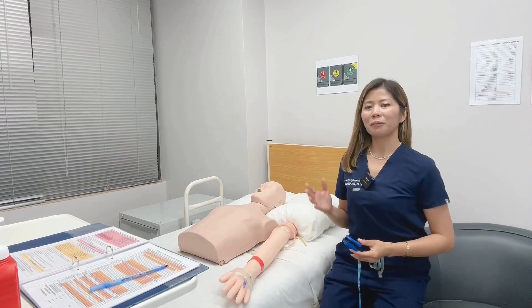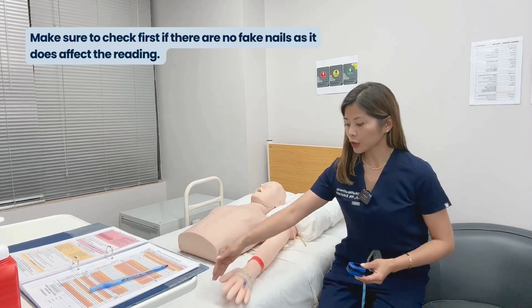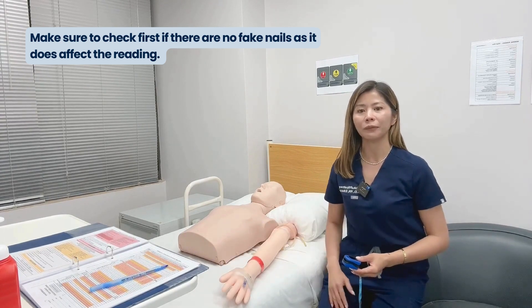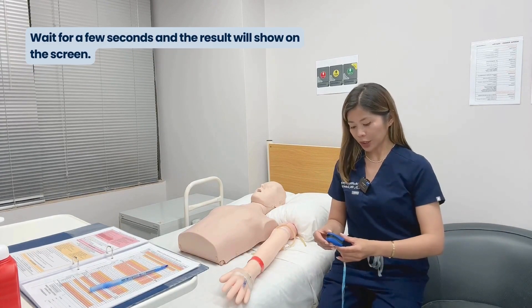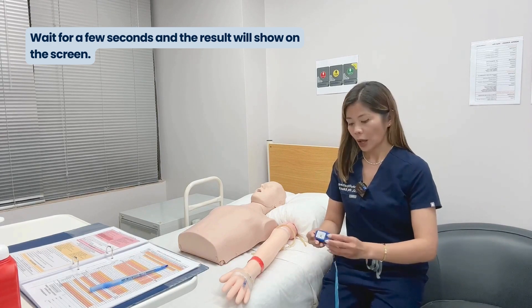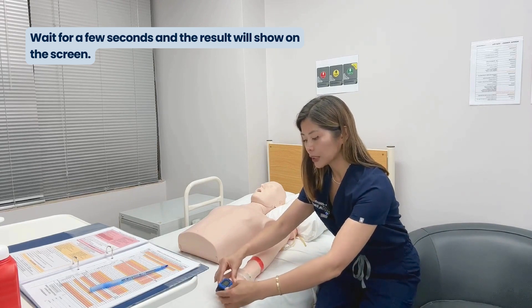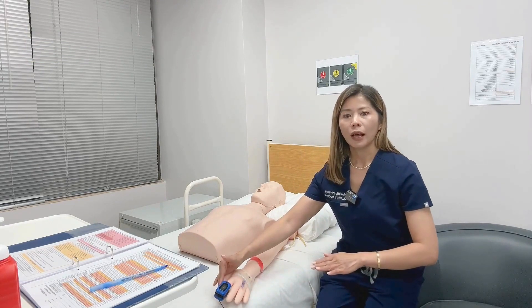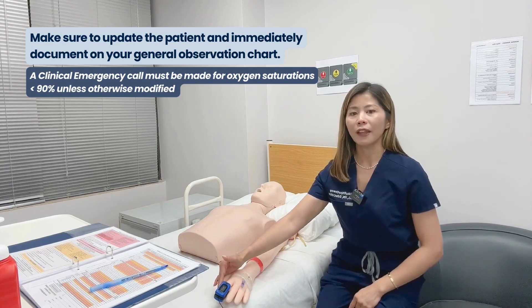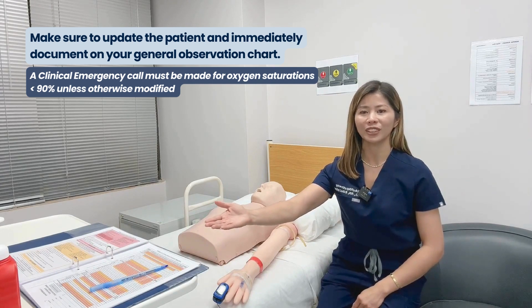To measure the patient's oxygen saturation, make sure to check if there are no fake nails, as it does affect the reading. Now, turn the machine on and wait for a few seconds. Usually, it will also turn on once you put it onto the patient's finger. Make sure to update the patient's oxygen saturation, then make sure to immediately document on your general observation chart.